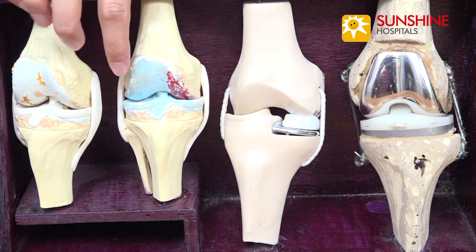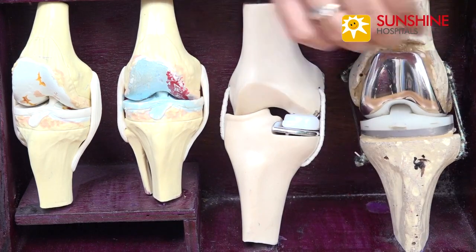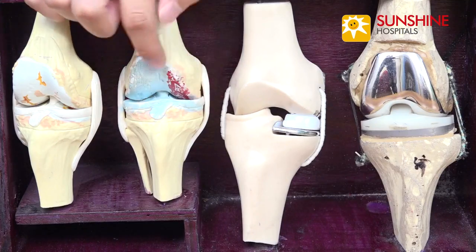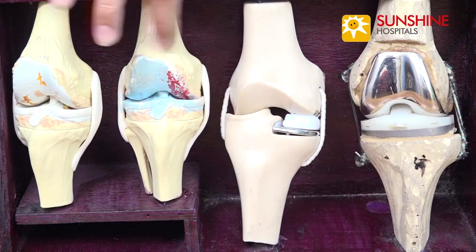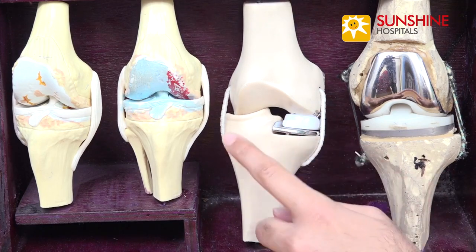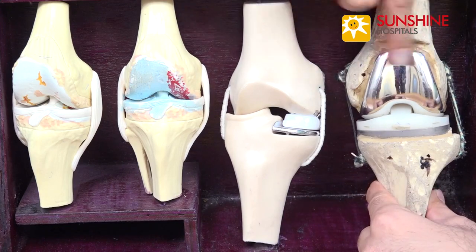For some patients, the wear is only restricted to the medial side of the knee joint. If we go ahead with a total knee replacement, we're cutting off the damaged area as well as the good normal area. Going back to the car analogy — it's like when you have one worn out tire, replacing all four tires just for that one. So in this kind of situation, we perform a partial knee replacement. We are only replacing the medial side which is damaged, and we do not touch the lateral, normal part of the knee joint. This lateral part has been completely left alone, and this is the medial part which was damaged and has been replaced with the implant.